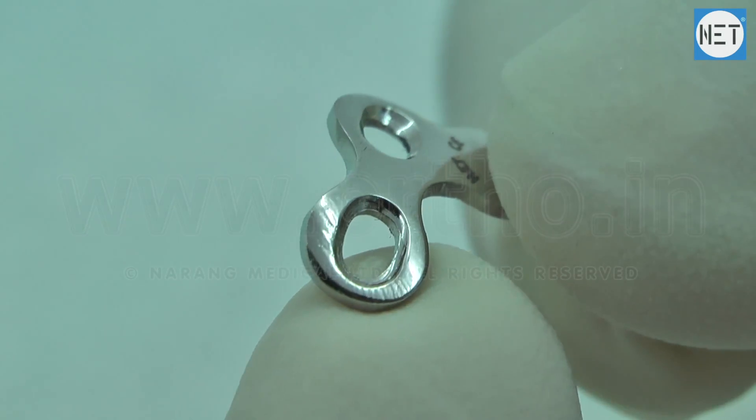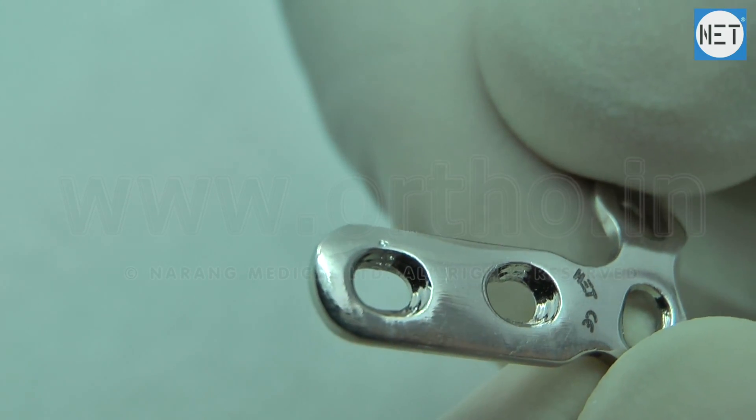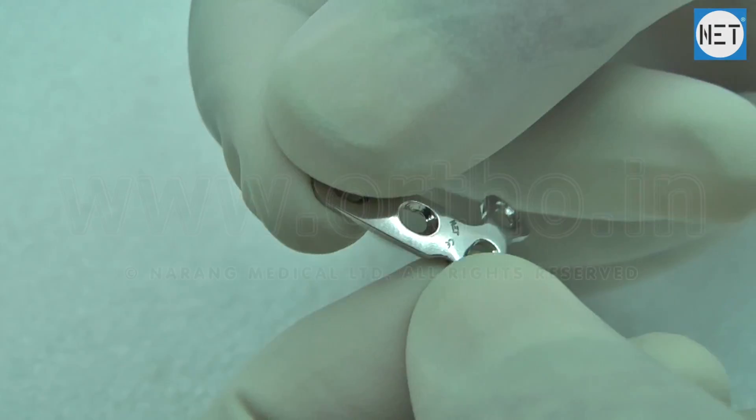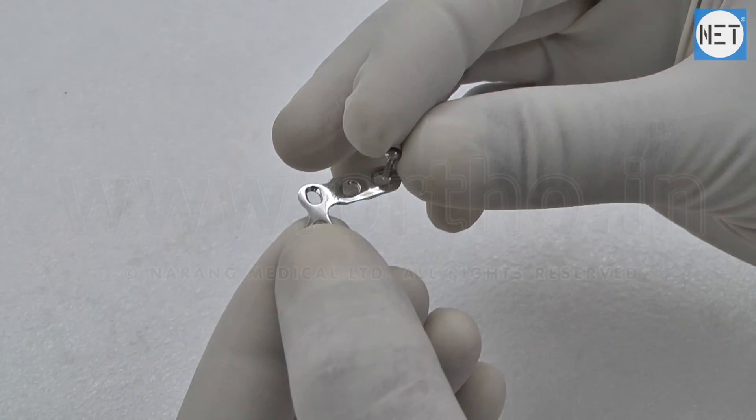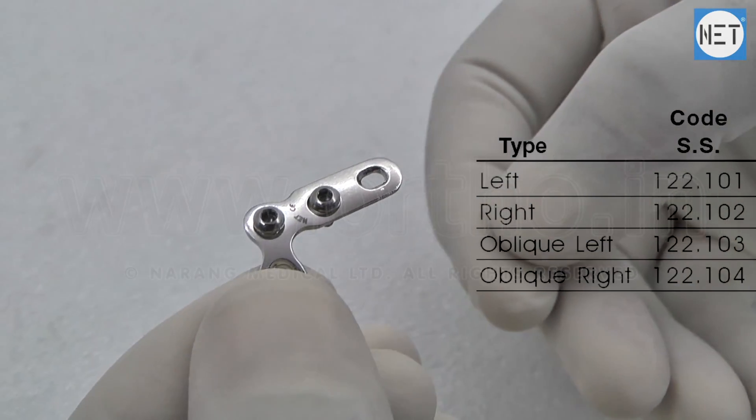All holes of these plates support 1.5 and 2 mm cortical screws. Narang Medical offers these plates in 4 types: left, right, oblique left, and oblique right.